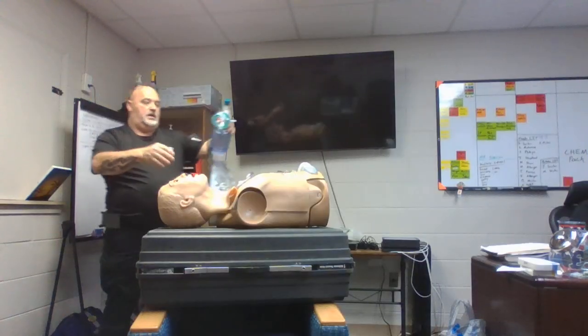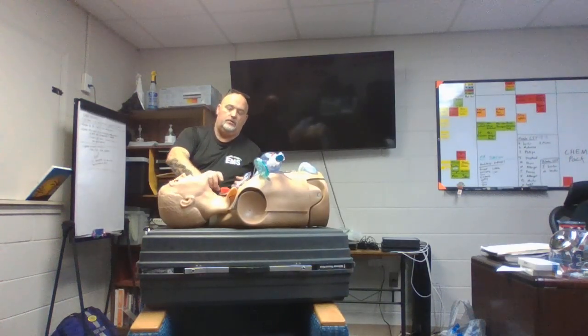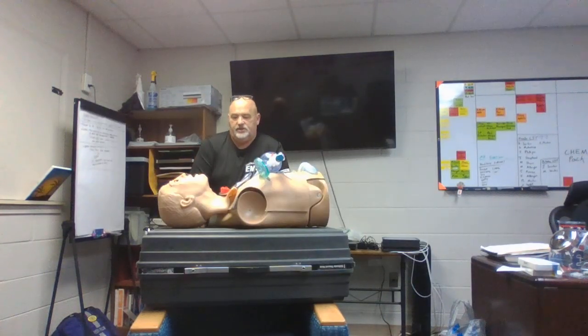Adults have a tidal volume of around 400 to 600, depending on the height of the patient. So when you have the big bags that are 1,000 or 1,250, and you're squeezing that thing, you're doubling the capacity of the lung. What's going to happen?